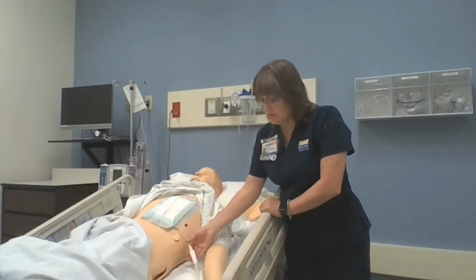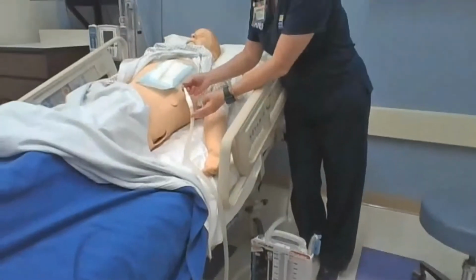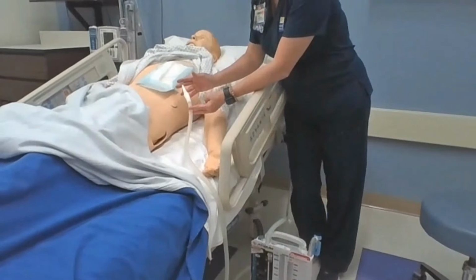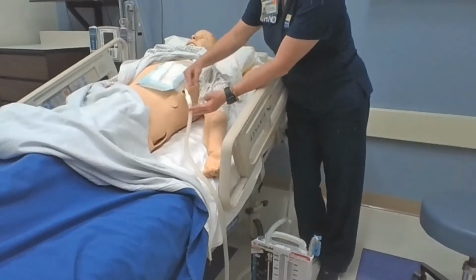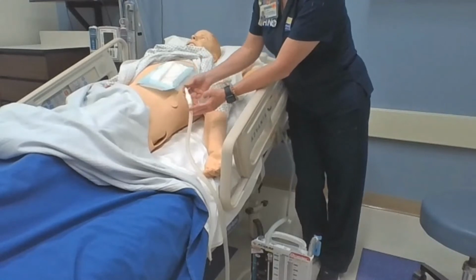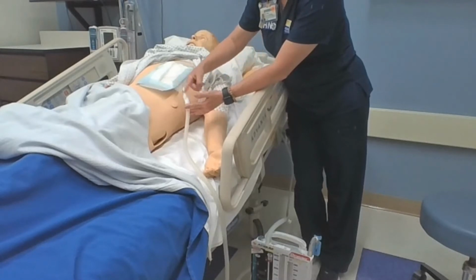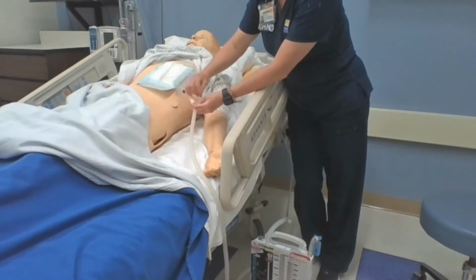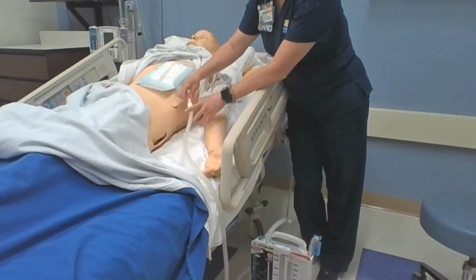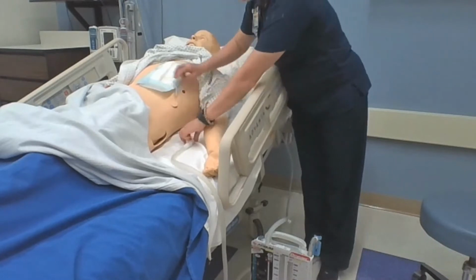First thing I'm going to come to is the connection. Now the connection is connecting the chest tube to this drainage tube. It should be, per your ATI, taped in a spiral fashion. Basically, we just want to make sure that the chest tube and the tube are connected, and that there is a continuous piece of tape going across, and that it is somewhere that you can peel it back if I needed to change out this tube. Okay? I'm then going to, oops, there goes my chest tube.